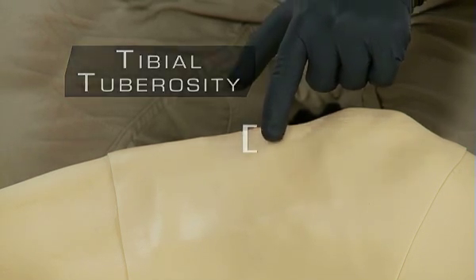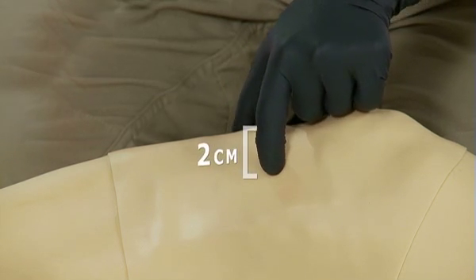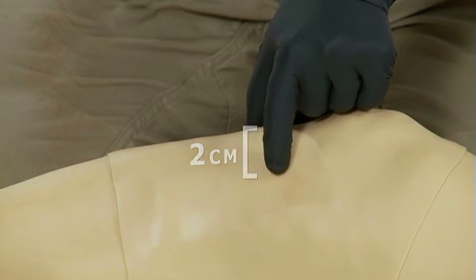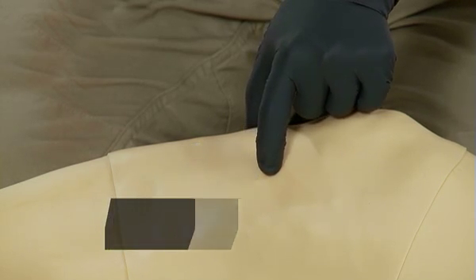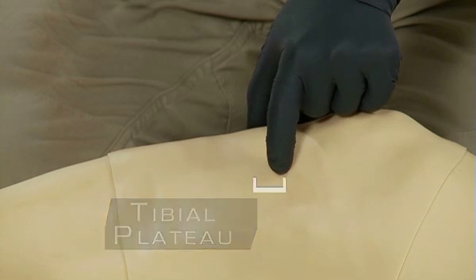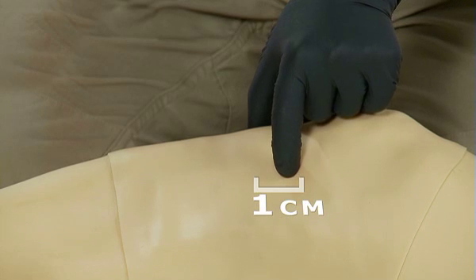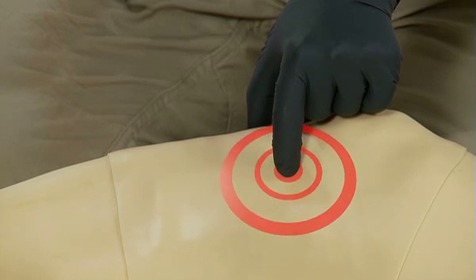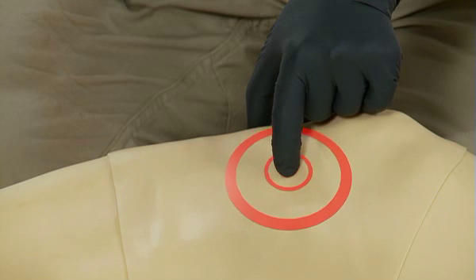For adult placement, begin at the tibial tuberosity and go approximately two centimeters medially, or toward the inner part of the leg, to find the flat portion of bone. This is called the tibial plateau. From the tibial plateau, go up approximately one centimeter, or a half an inch, approximately toward the patella. Our goal is to deploy the needle through the thinnest portion of the cortex and in the area that contains the highest vascular content.